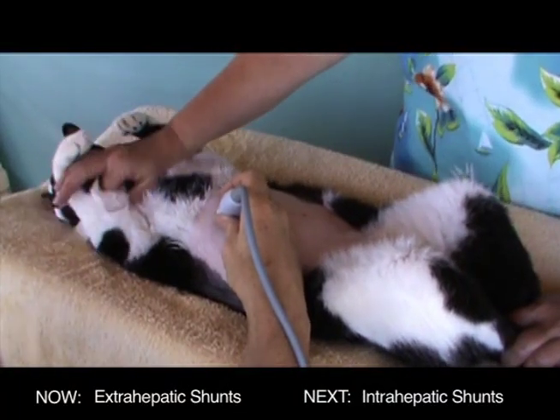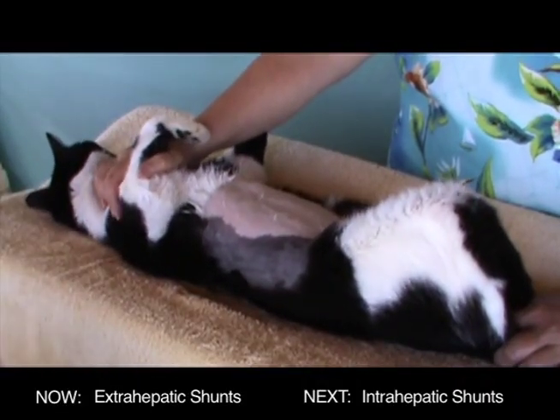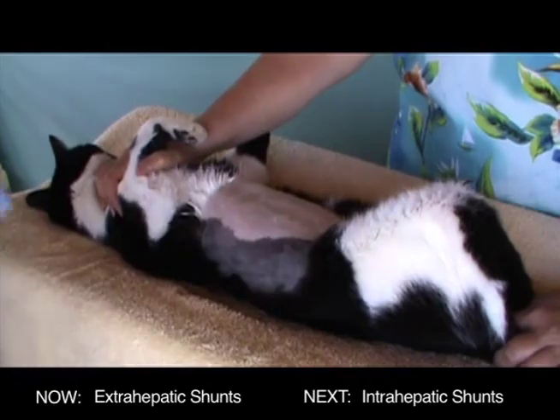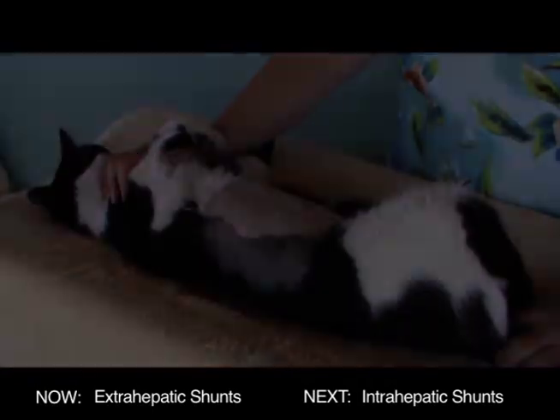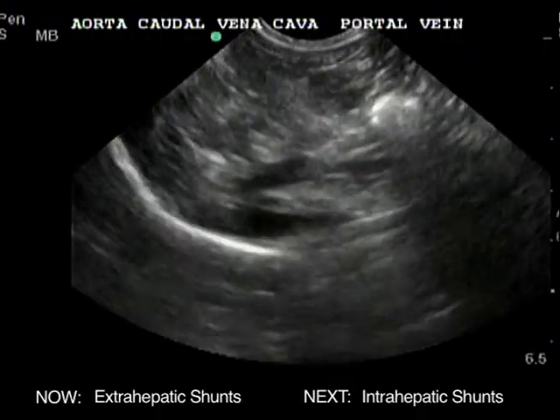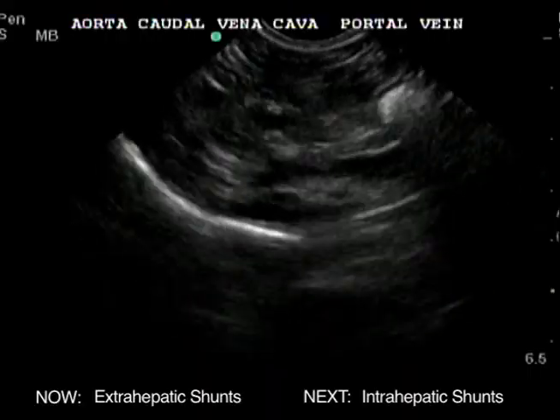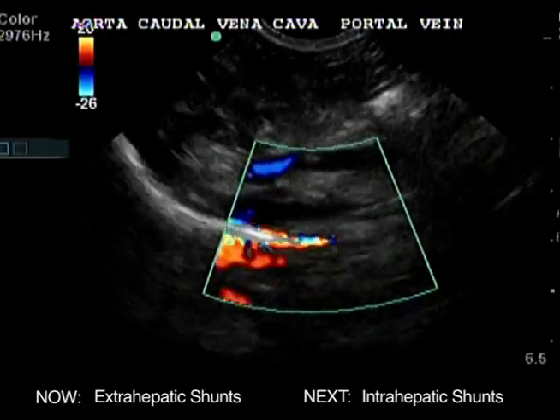Small transducer movements are used to line up the extrahepatic portal vein, caudal vena cava, and aorta. On the ultrasound screen, the liver, extrahepatic portal vein, caudal vena cava, and aorta are seen.